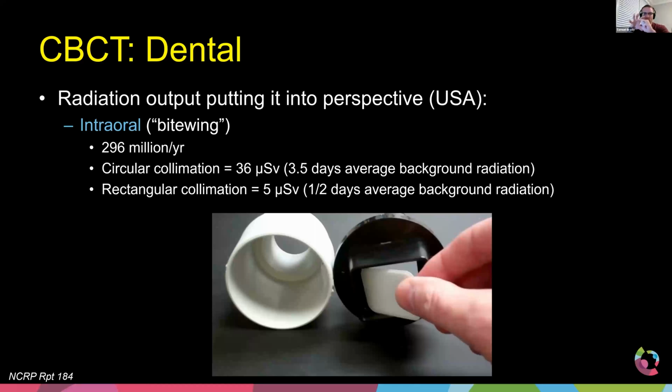The whole reason that we use these large circular collimators is so that you don't have to be very accurate where you place the X-ray tube when you're imaging the teeth. With training and some experience, when working with our dental hygienists and dental technicians, the people that actually take the X-rays, they've gotten really good, because there are ways to align it. There are tools that help you align it really easily. So you put the tube in, you get it aligned properly, and you pull the trigger, and there's not a lot of cut. With experience, there'll be no cut, or image cutting, or loss of image.